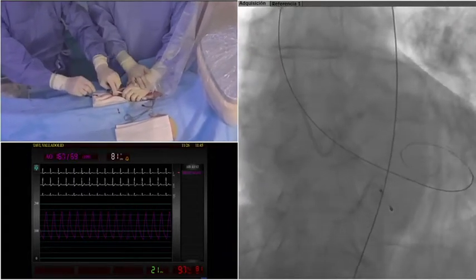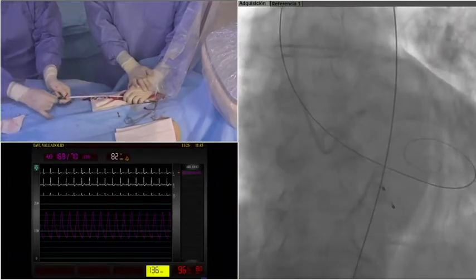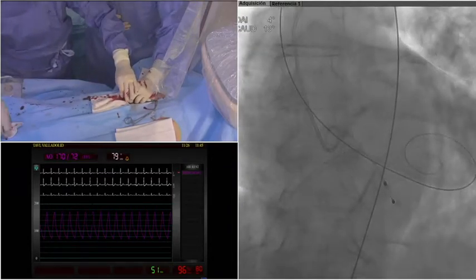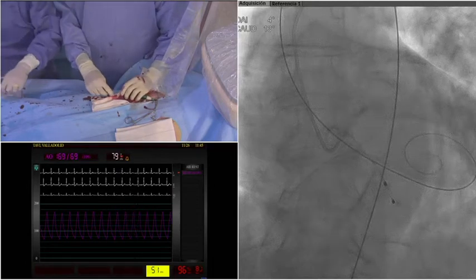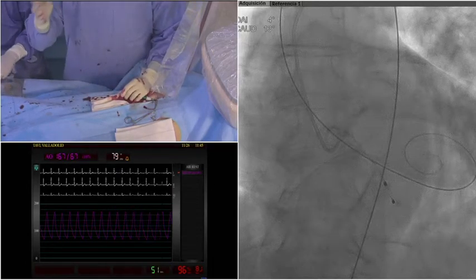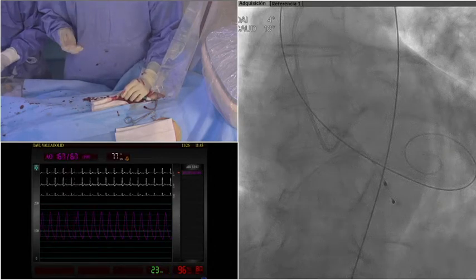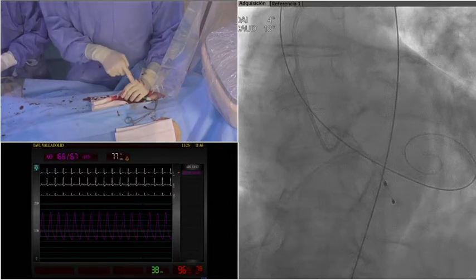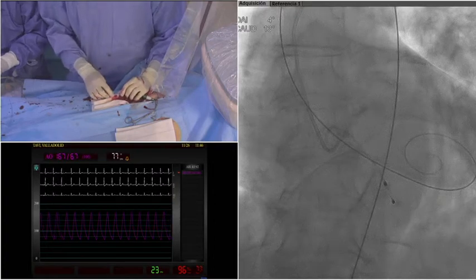Can you confirm, Ignacio, that in case you need it, you can remove the valve, the assembly, through the sheath, to change it, for example, if you are not satisfied with the valve? So imagine that while we are going up, we lost the wire from the ventricle. In that case, it's a challenging situation. We can remove all the delivery system with the valve inside without removing the introducer. This is something that I wanted to stress because it's a big advantage.